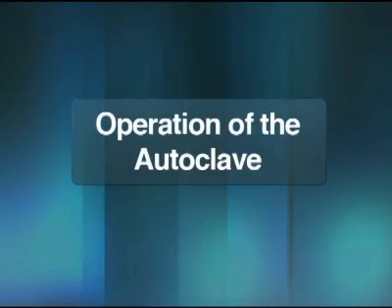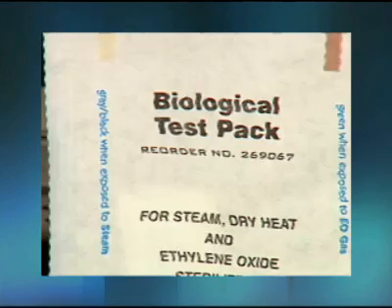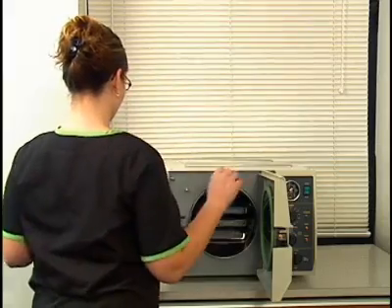Operate the autoclave according to the procedure outlined in the instruction manual accompanying your autoclave. The general procedure for operating the autoclave begins by determining the sterilizing time for the type of articles being autoclaved. This information is indicated in your autoclave instruction manual. This load consists of wrapped surgical instruments along with a biologic indicator. The instruction manual indicates that they should be sterilized at 250 degrees Fahrenheit for 20 minutes.